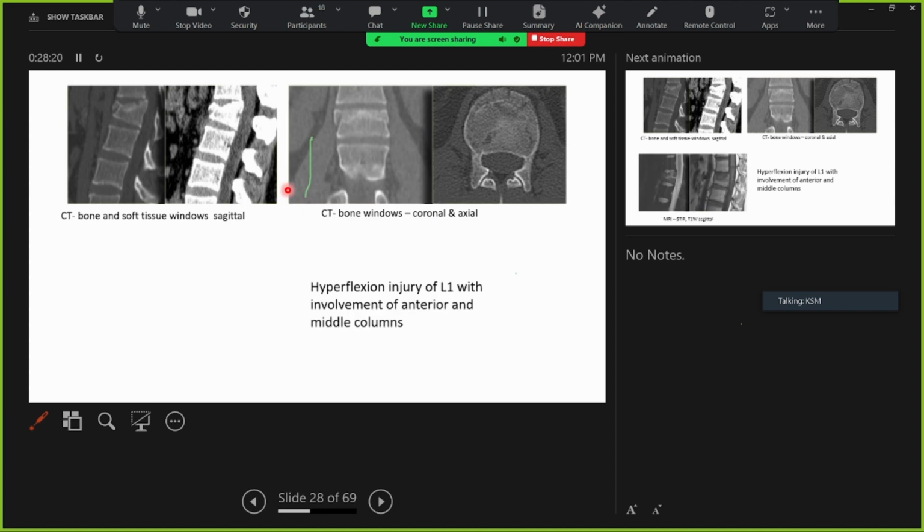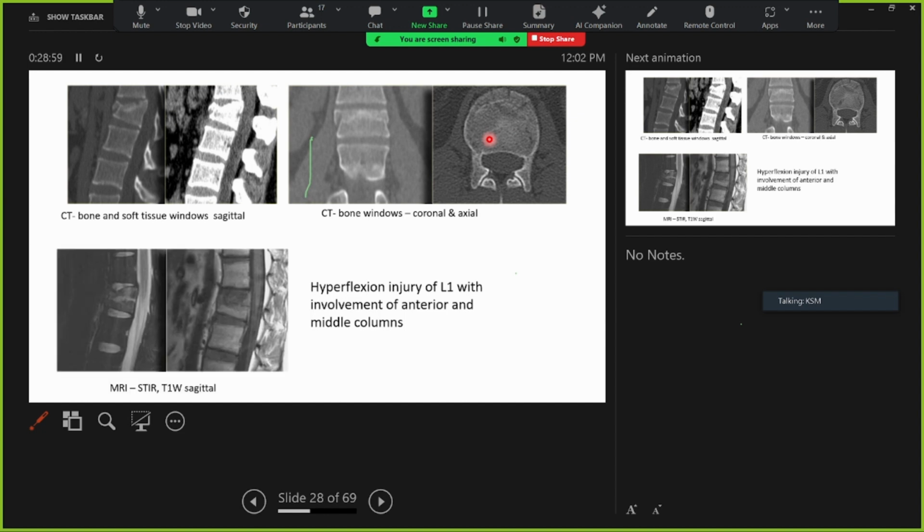So this is a patient presented after RTA. Now again you can see there is some abnormality in this vertebra. What happened? There is some fracture, reduced vertical height, and not like the previous one, wedge fracture. Here, the posterior vertebral body is bulging into the spinal canal. So there is a narrowing of the spinal canal. We don't know about the neural contents. So this is the AP. You can again see the fractured segments are bulging away from the vertebral margin. Again, this is the axial image. This kind of patient, if neurological symptoms are present, should undergo MRI.